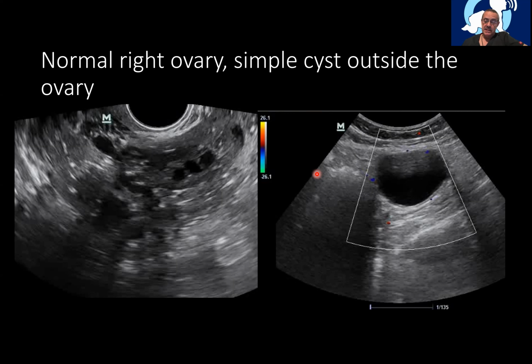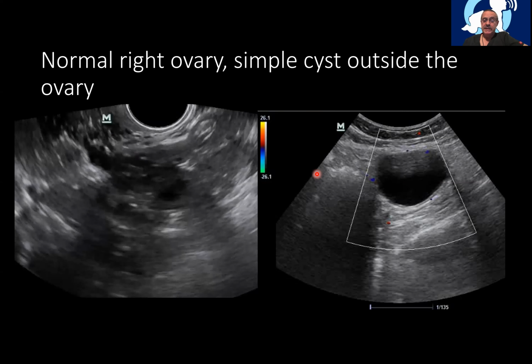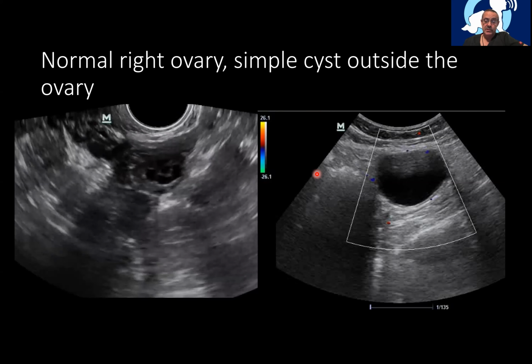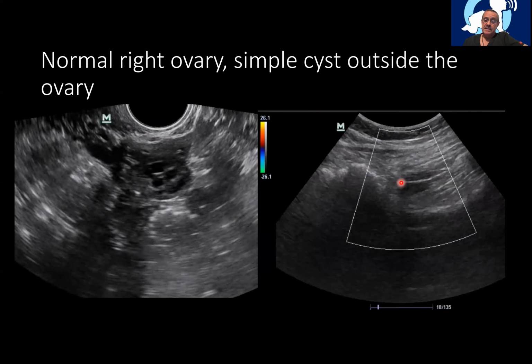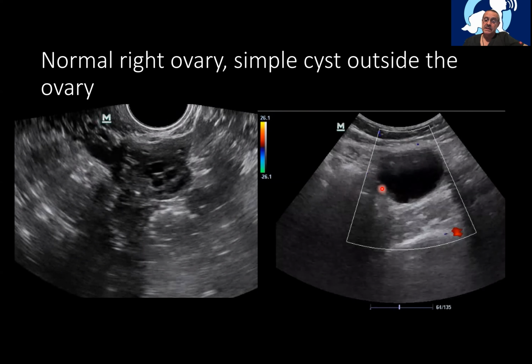Sometimes those are paraophorous cysts. Those small cysts which hang from the tube and just are good to confuse ultrasound people. Normal right ovary, no cyst, nothing related to that. The cyst, intestine, cyst, intestine.